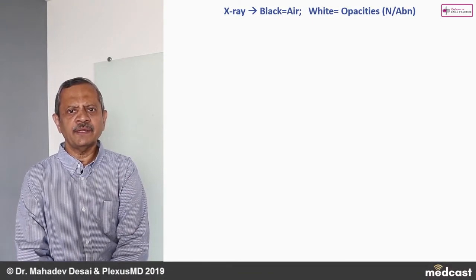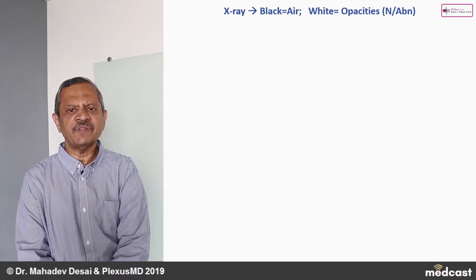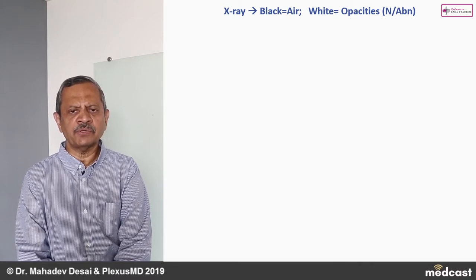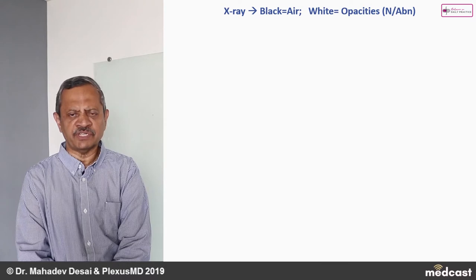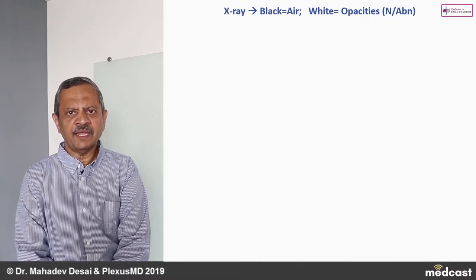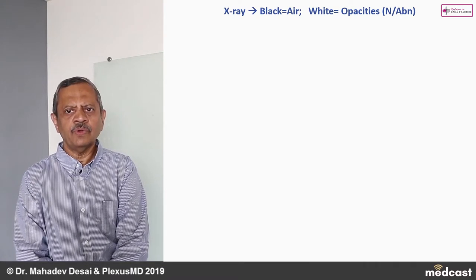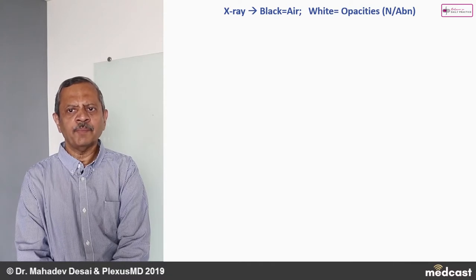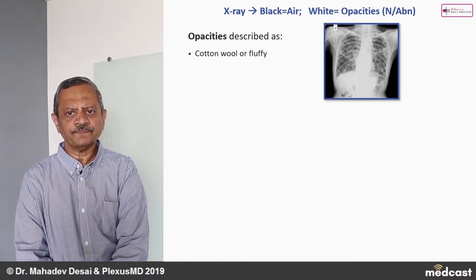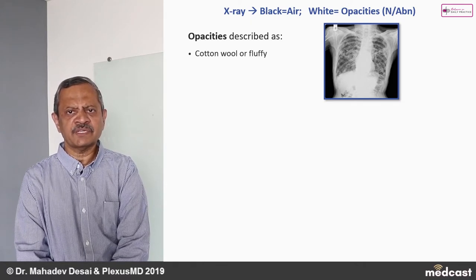Let's begin with abnormalities in chest X-rays in the lung fields. The lungs appear black because lung has air, which gives a black shadow. If there is too much black shadow, we call it radiolucency. Most abnormal shadows are white shadows, called opacities. Opacities can also be due to normal structures within the mediastinum, like the heart or diaphragm, so opacities need not always be abnormal.